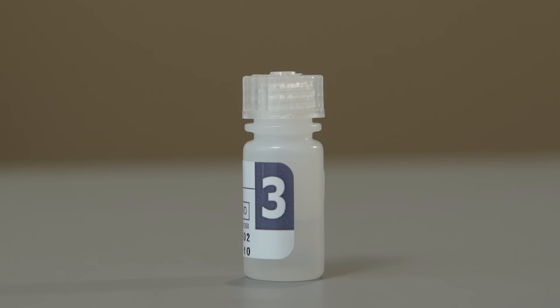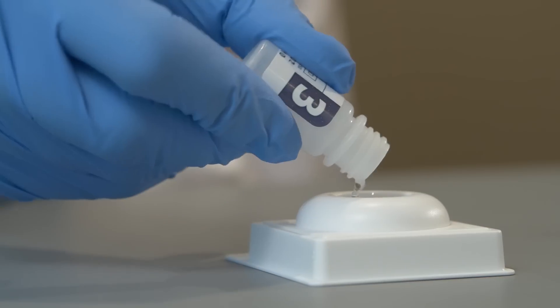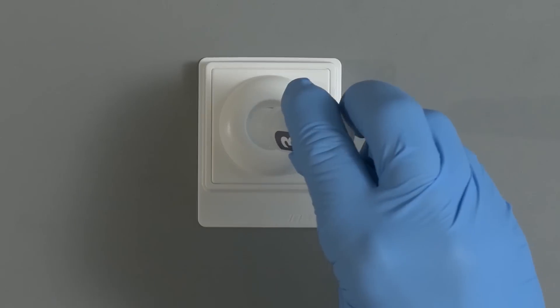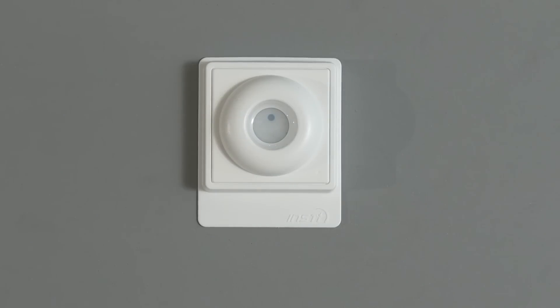Open bottle number three, the clarifying solution, and pour the entire contents into the centre of the membrane unit well. The solution should be absorbed completely. The clarifying solution will reduce the background to provide more contrast to the spots and facilitate reading.